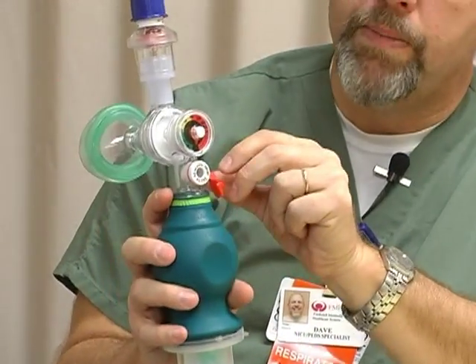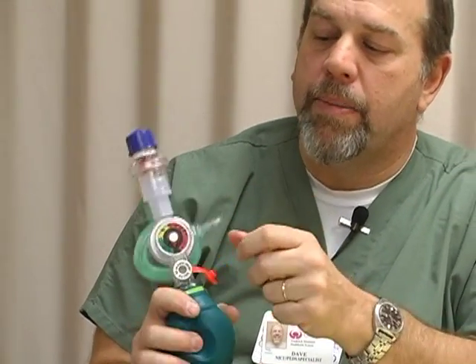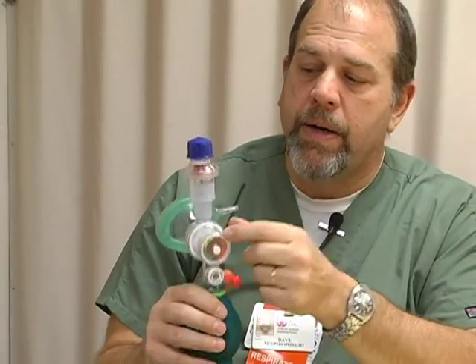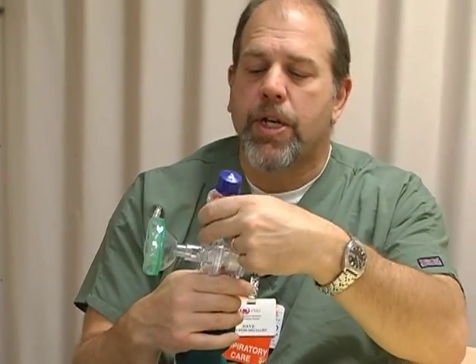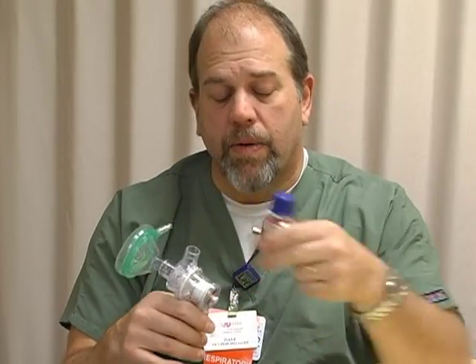So to recap: number one, most important — keep the pop-off valve open at all times. Number two — the pressure manometer is right here. Number three — the PEEP valve is just a little bit different because we have to use the white adapter, but it does fit and sits right on top.